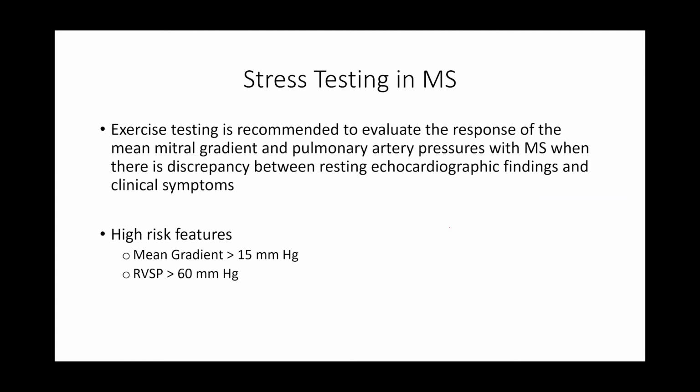But on that, we found the patient had a mitral mean gradient around 8 to 9, and pressure half time was also around 200 to 210. But the patient was completely asymptomatic. There were no symptoms at all. Then we asked her to do a little bit of exercise and repeated the echo, and the gradient increased, the pulmonary hypertension increased, and we referred that patient to the cardiologist for some kind of intervention.